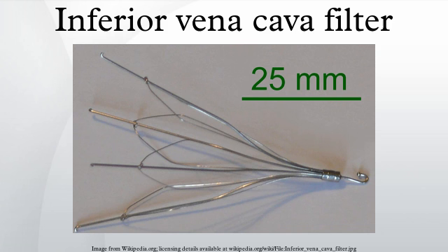someone qualifies for removal: no need for permanent filter, remove temporary; low risk of significant PE, continued anticoagulation is working, remove temporary; no expected near-term high-risk PE, continuation of anticoagulation therapy, remove temporary; life expectancy of more than 6 months, remove temporary; ability to retrieve the filter, no complications, no tear probability, no trauma probability, if so, remove temporary; patient guardian agrees, fully consented, fully informed, if so, remove temporary.